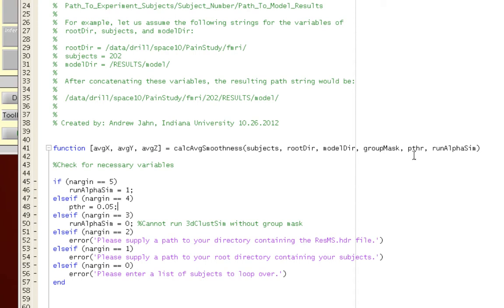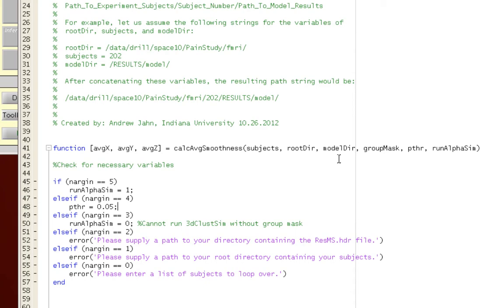It needs a list of subjects, a directory pointing towards where the subjects are located, and then a path pointing towards where the res.ms.header file is. This is the residual file, which SPM estimates smoothness will then take in, and it will estimate the smoothness parameters from that.